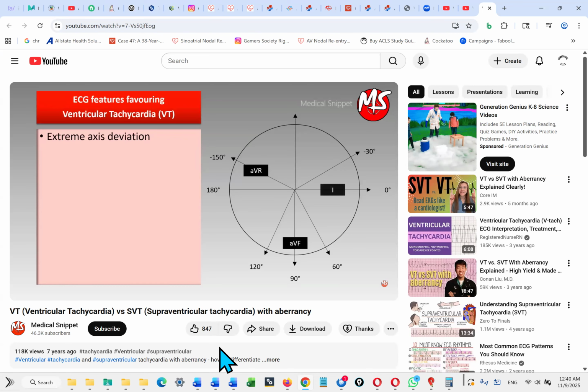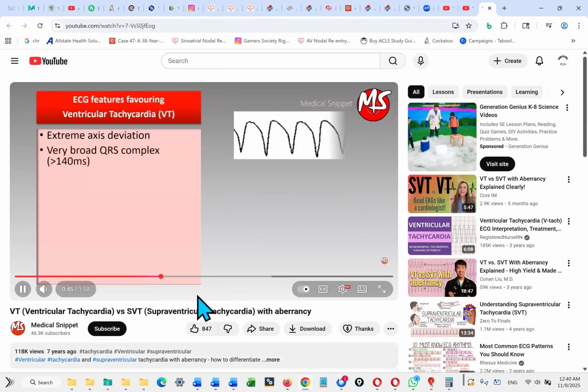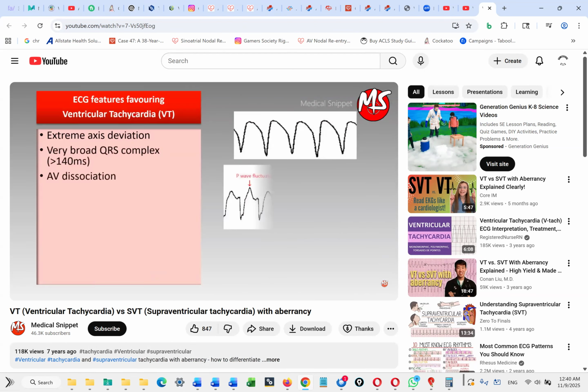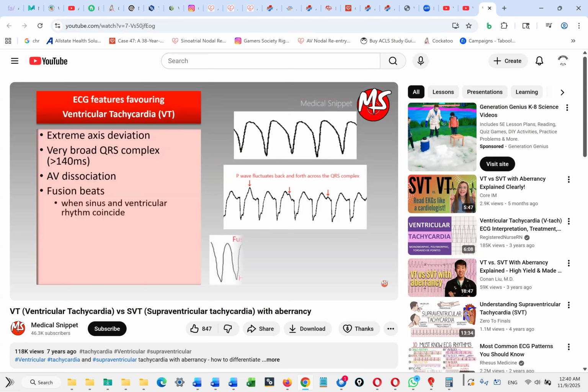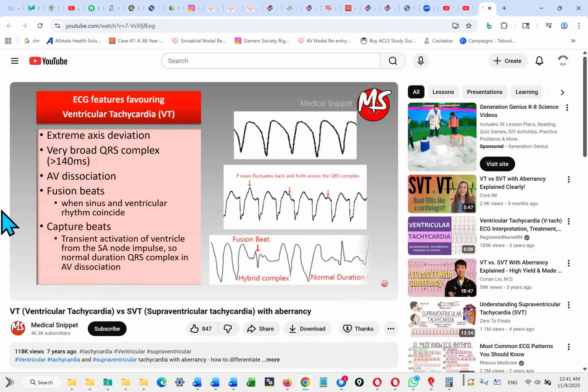Yeah, ventricular tachycardia, you cannot find the axis. It's not possible to find axis. See, how do you find axis with that? That's just a nonsensical thing. But it depends on if it's negative deviation or positive. But if there's VT, you really cannot tell much from the axis because VT is so obvious on a tracing. Okay, so there's the criteria they're saying. Very wide QRS complex. It has a very unmistakable look. This kind of huge mountains.